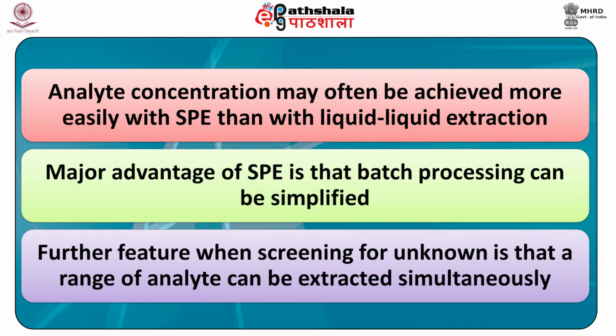Analyte concentration may often be achieved more easily with SPE than with liquid-liquid extraction, as use of an SPE column to concentrate an analyte from the solvent extract may provide a quicker and possibly safer alternative to solvent evaporation.